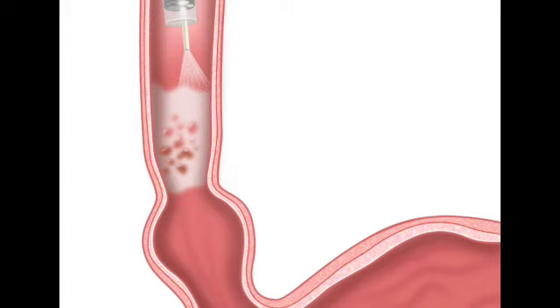Exactly right. The acid temporarily alters the structure of the proteins on the surface of the healthy esophageal cells. Oh, whoa. Yeah, they clump together slightly. And this structural change alters how light from the endoscope's camera reflects off the tissue. Instead of absorbing the light and looking pink and translucent, the altered proteins reflect the light back, making the tissue appear completely white to the camera.